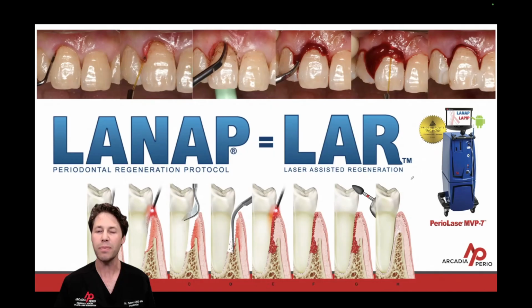We're going to wake up the bone. We're going to wake up the stem cells. We're going to get those stem cells released in the form of a laser-generated blood clot that happens in step E. Once we do our laser-generated blood clot, this acts as our protective barrier. This acts as our membrane around that periodontal defect.